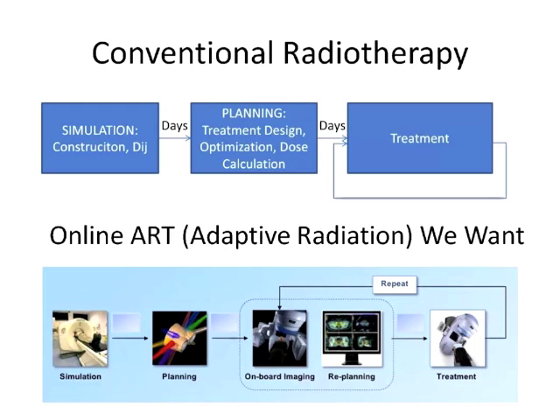To do that, the tool algorithm is there. Not much changing. To accelerate it, we have to parallelize the tools. You can parallelize using existing CPU cluster tools, or you can use GPU. We started to look at the CPU clusters in the beginning, but at the same time, GPU hardware came. So we decided to look at both of them and see which one might be a better fit for us.